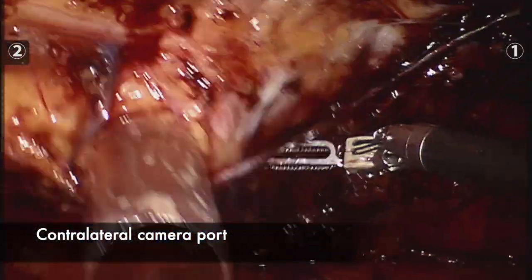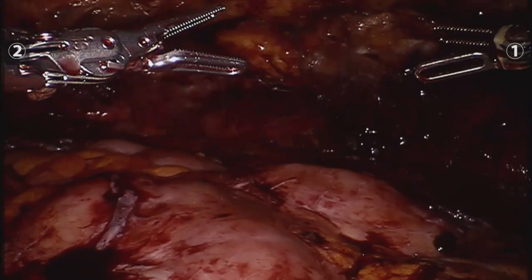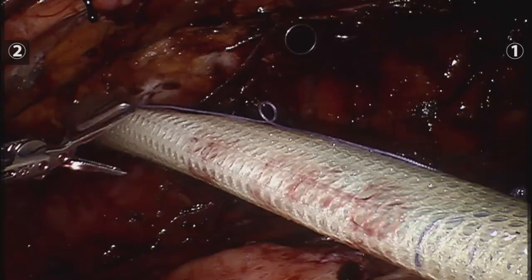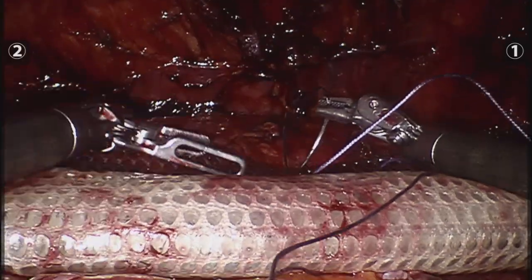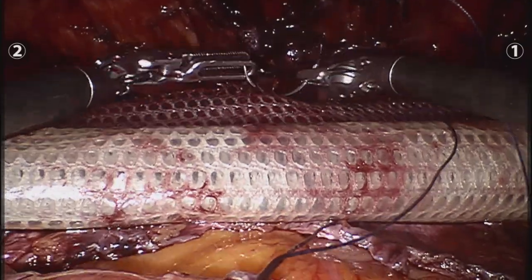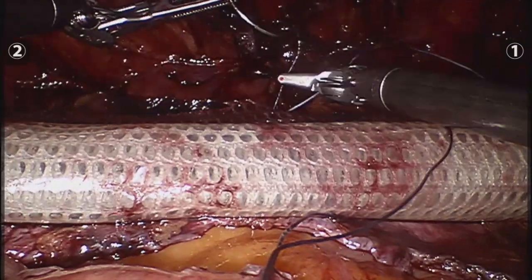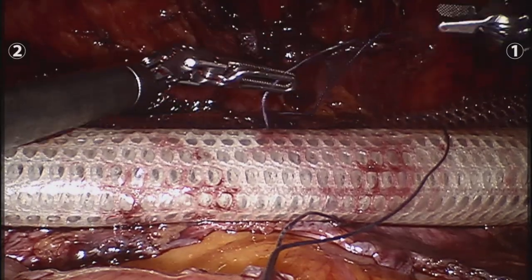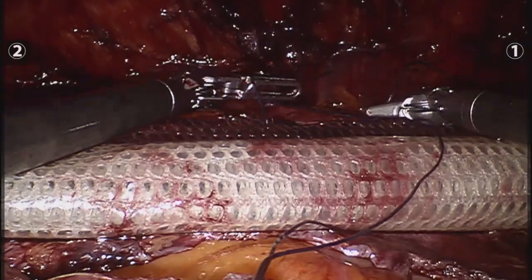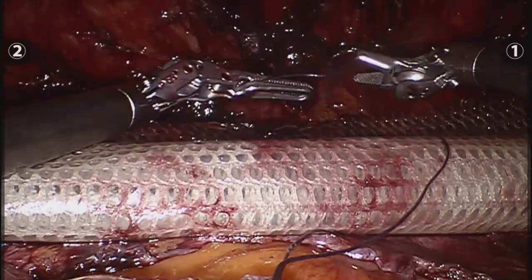I inserted the trocar on the contralateral side and the mesh was brought inside the abdominal cavity using the rolling trick that Dr. Bellasert shows on his videos. That really makes it very easy to place the mesh inside the abdominal cavity and then unroll it so it lays nice and flat.